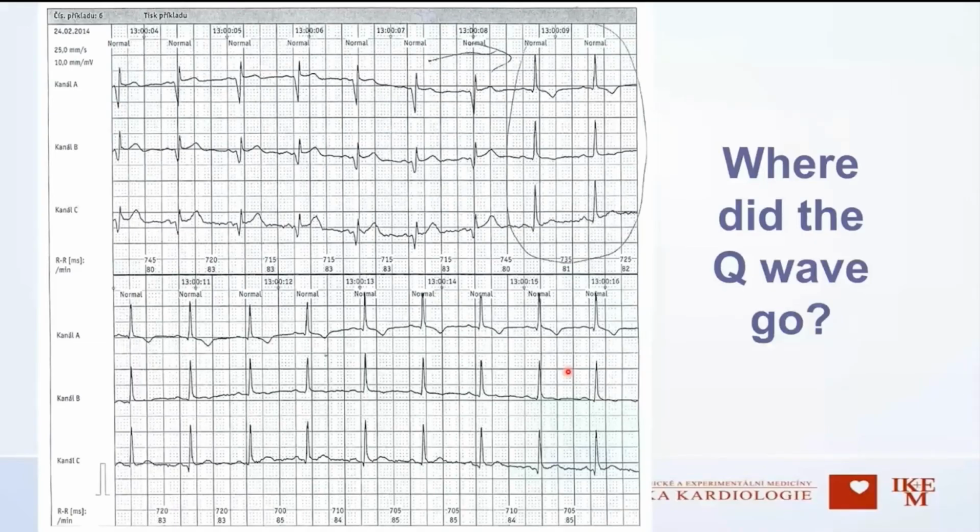Most people believe that the Q waves should be negative, that the delta waves should be positive, but sometimes it might mimic a Q wave after myocardial infarction. So people with a posterior septal accessory pathway are believed to have a posterior or inferior MI. And this is Holter monitoring of a patient that has a Q wave, and suddenly, abruptly during the day, he loses the Q wave.